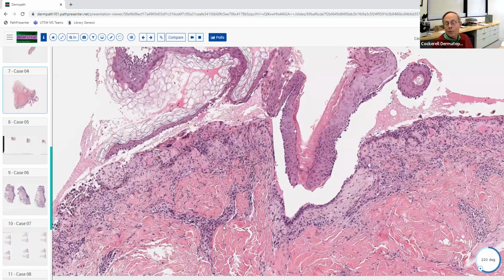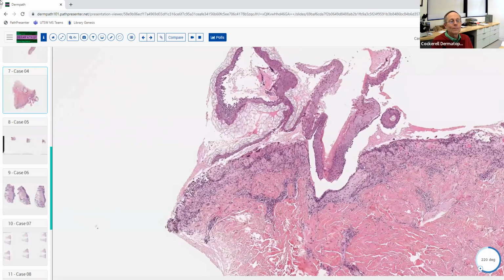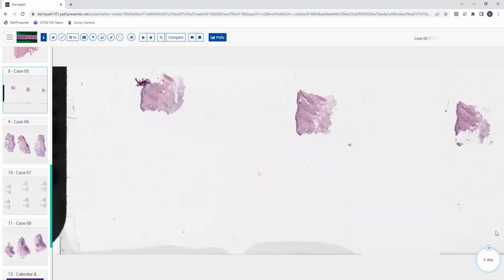So there are 5 subtypes, maybe 6 subtypes now, of Grover's histologically. So if you see a biopsy and the best answer here is Pemphigus, and they're trying to trick you and say Pemphigus vulgaris subtype of Grover's disease, you would never choose that because it goes down the follicle here. So you would know that that's wrong. So now you know. Gotcha, that's helpful. Thank you. Okay, you're welcome.